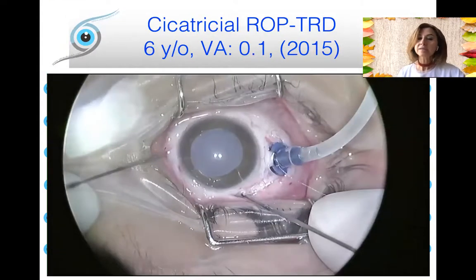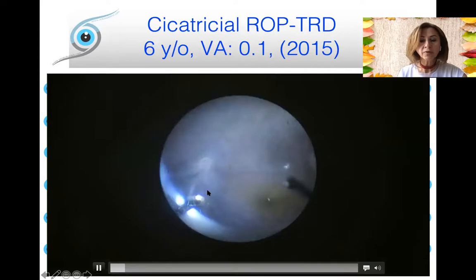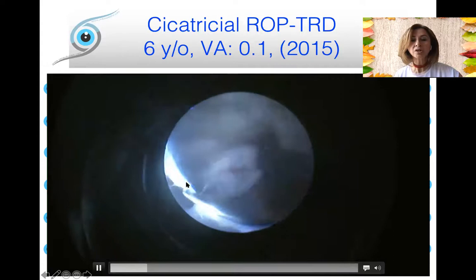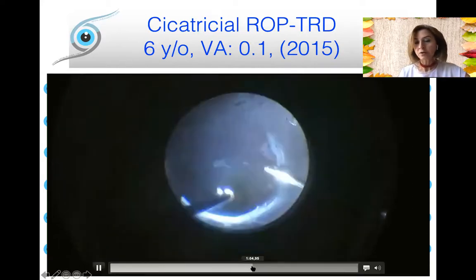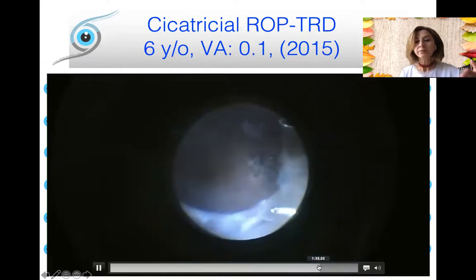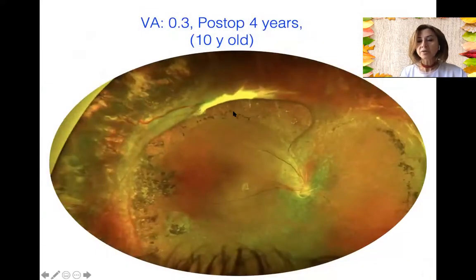And this was a 6-year-old boy with cicatricial ROP. Vision was 0.1. I operated in 2015. As you see here, the macula was in a superior and temporal ectopic position, but I can see that there is anteroposterior traction in the superior periphery. So when I relieve these membranes effectively, I know that I could preserve this vision in the near future also. You don't have to peel all the membranes, but peel as much as possible, relieve as much as possible. And I could do this without doing a lensectomy, so a lens-sparing vitrectomy was possible. So this is the result. You see some remaining membranes, but no problem. Even after 4 years, vision was 0.3, quite good.